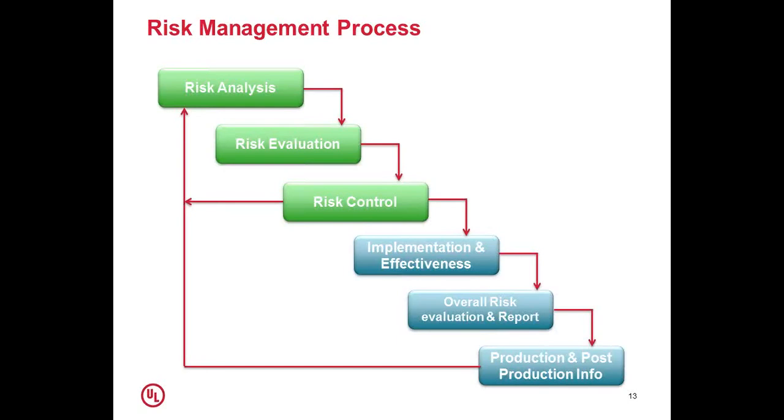Here we are not going to introduce you to implementation and effectiveness, overall evaluation, the risk evaluation report, and post-production information, because this risk management process is a dynamic process. It doesn't end with a risk control implementation. We will also have to verify the effectiveness of this implementation, and then we need to see if overall all the risks have been evaluated and all the risks are acceptable, and we need to document them in a risk management report.